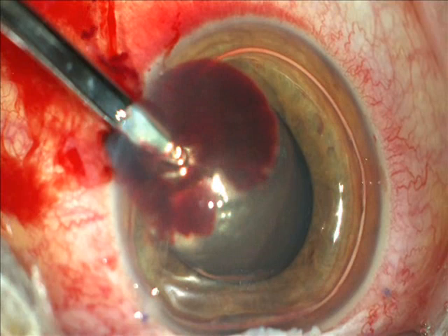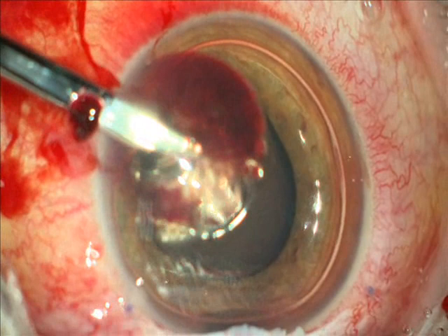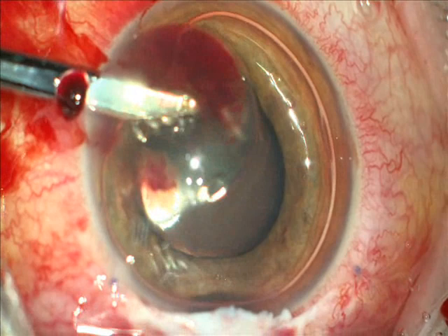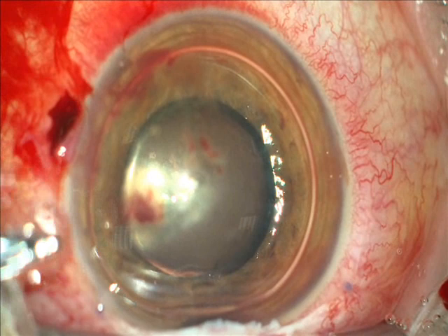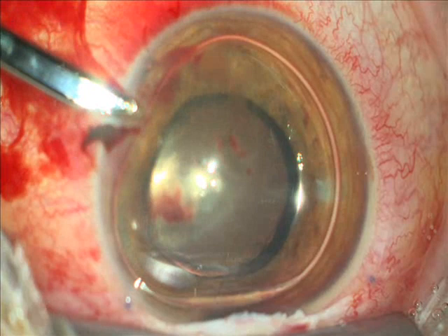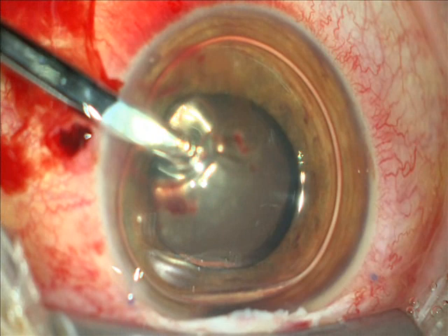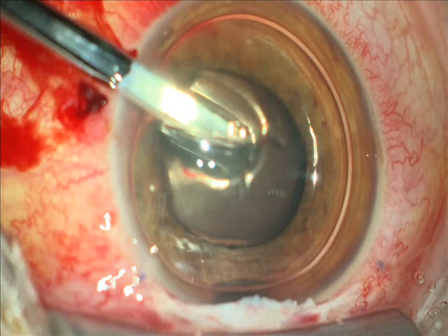Here I reduce the irrigation to avoid an extension of the Descemet's detachment. It doesn't matter too much if it extends a little, because the treatment is the same. Special care is taken to maintain a clear center. Now I work with the Simcoe cannula between Descemet's membrane and stroma.